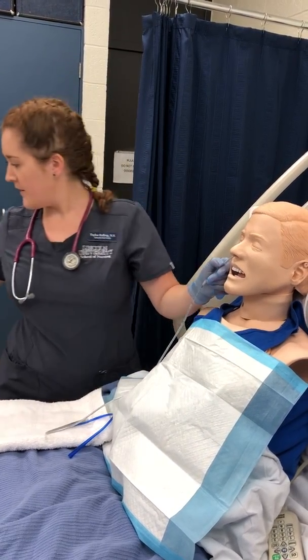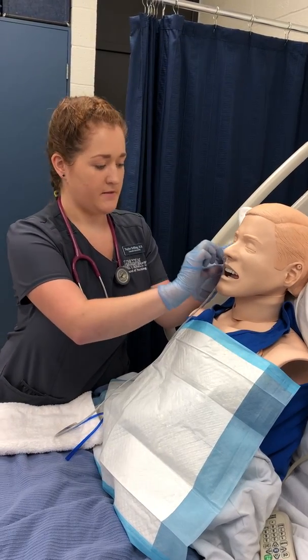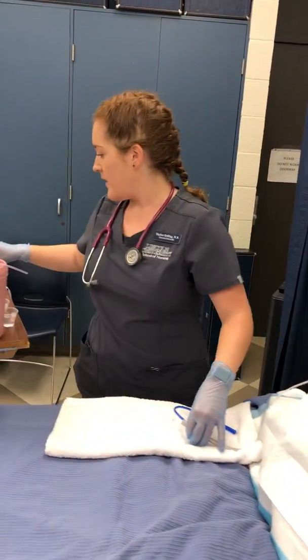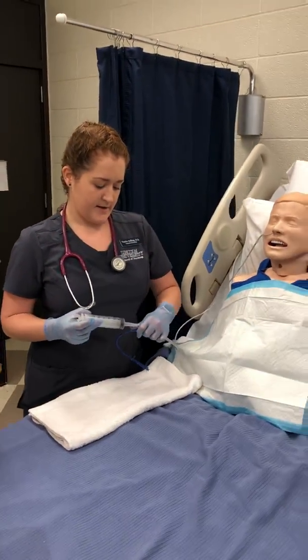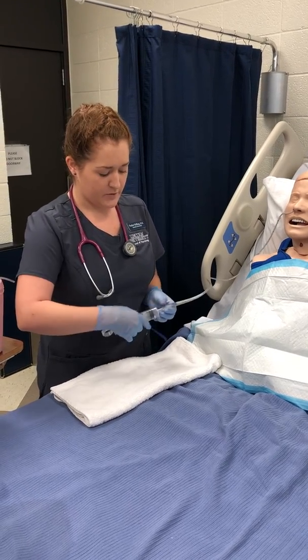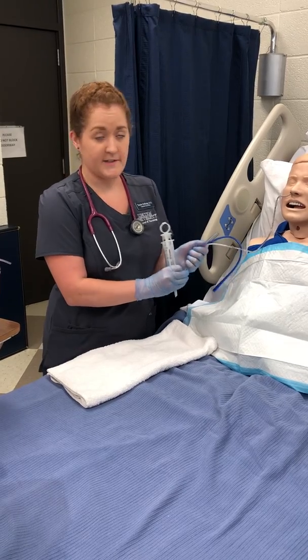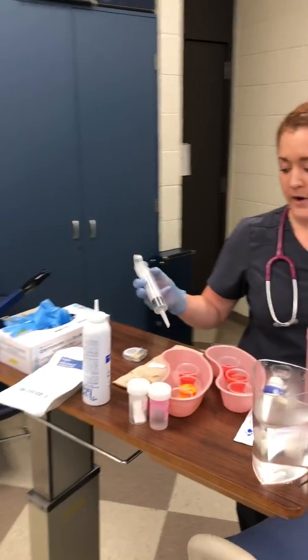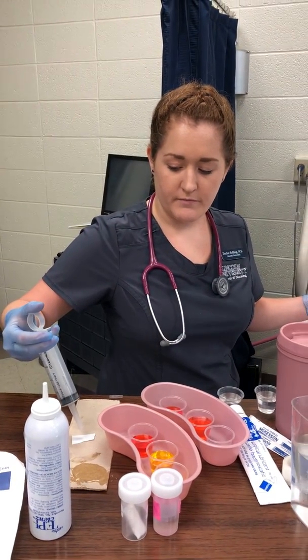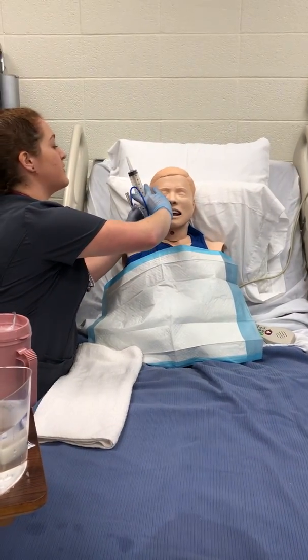There we go. I'm going to use another piece of tape to temporarily secure it while I check for placement. You can check for placement in a few different ways. The first way is to insert a syringe and aspirate contents, about 10–20 mLs. I'm going to clamp that so that an excessive amount of air doesn't get in there, and I have a pH strip right here ready for me. So I'm going to put the contents onto the pH strip and compare it. For proper placement, the pH should be between about 2 and 3. If it's higher than that, around 6 or so, that indicates it was placed in the lungs, not the stomach, and you would need to remove it and try again.